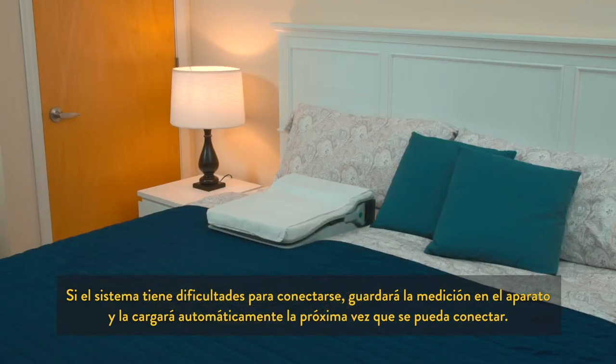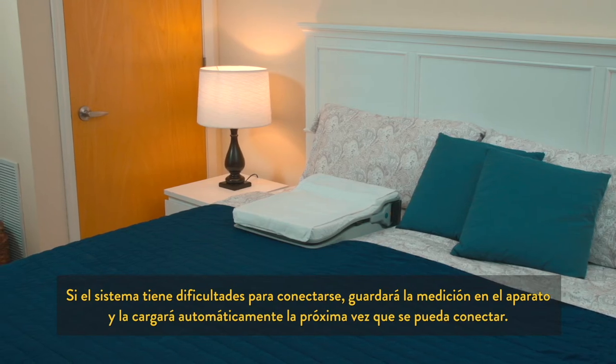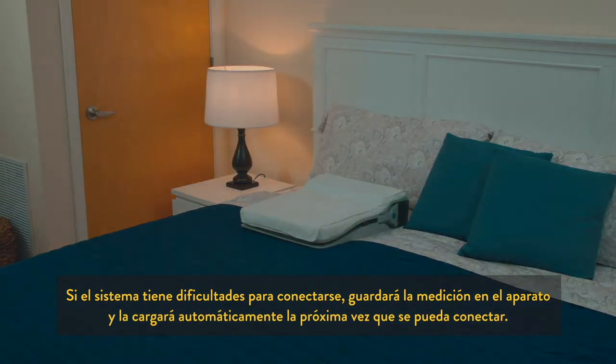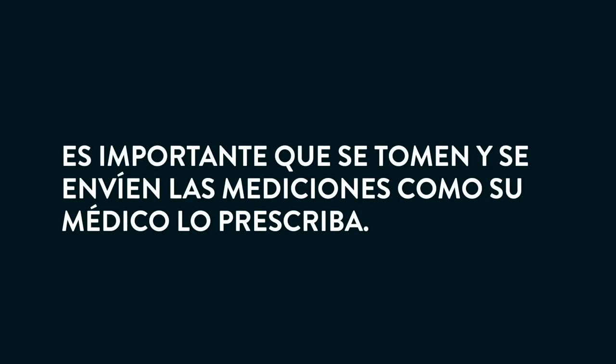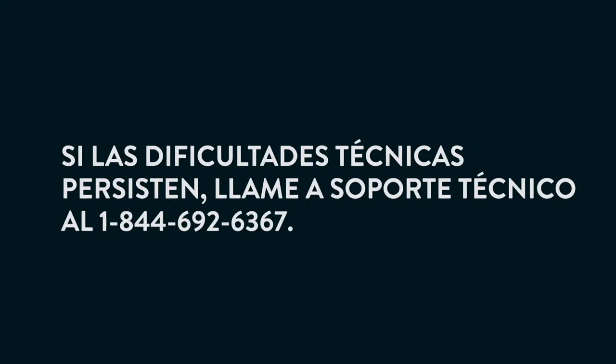If your system is having trouble connecting, your reading is stored on the machine and will automatically upload the next time it is able to connect. It is important that a reading is taken and sent as prescribed by your doctor. Refer to the troubleshooting section of this video, the quick start guide, or your patient system guide for assistance. If you're still having technical difficulty, please contact technical support at 1-844-692-6367.